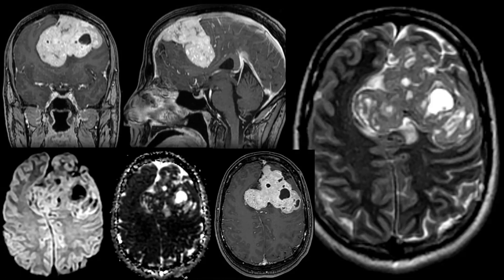Absolutely. Thank you, Dr. Singh. That was masterful. And the DWI and the ADC map are showing it's complex because of the cystic areas, but it is restricting diffusion. All right. So you've got that. Anyone want to venture a differential? That's a beautiful description. Venture a differential diagnosis. And now I'm going to show you the histology. Differential diagnosis. Atypical meningioma. I like atypical meningioma.